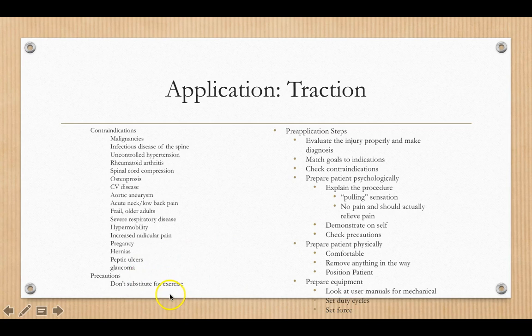Precautions, again, don't substitute this for exercise. We want to monitor them, want to make sure that their symptoms don't increase, and make sure that we have a good diagnosis. Pre-application steps: evaluate, set your goals, check your contraindications, prepare the patient psychologically.